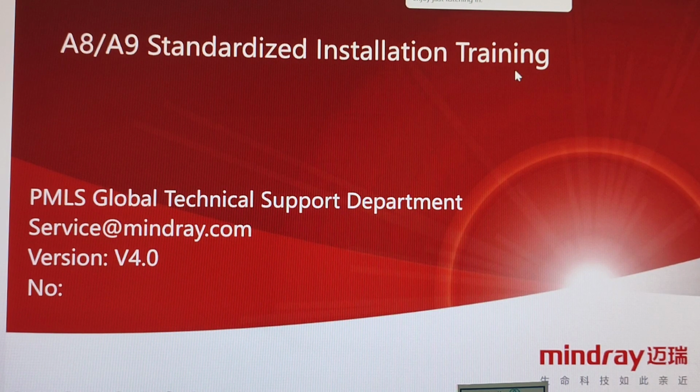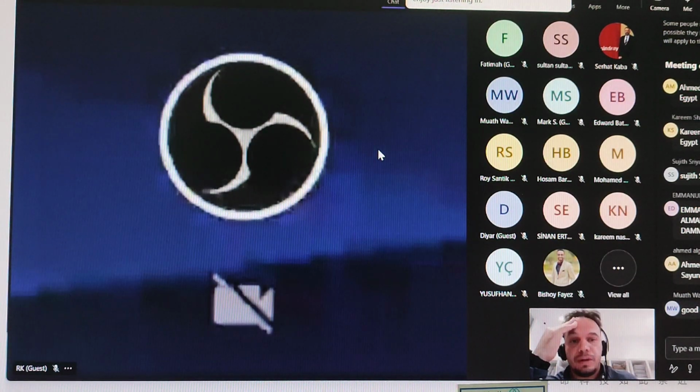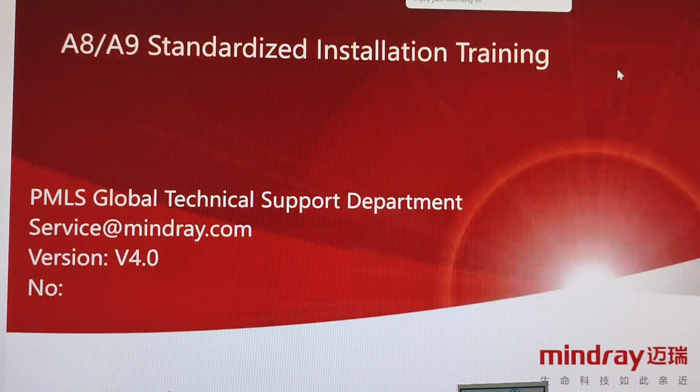So we can start installation training. So it's for A8 and A9. I'm expecting that you all know or have the basics of anesthesia. So let's start with a brief of the basics of anesthesia.